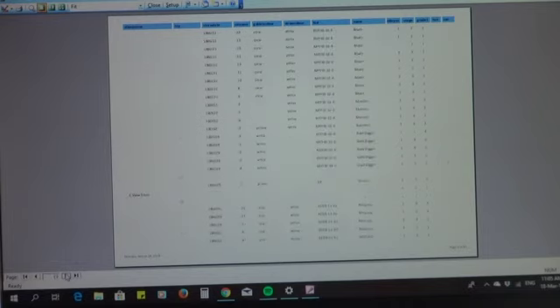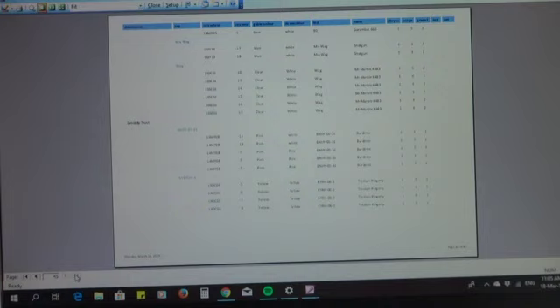Oh, there. Brown. Okay, so here's our donor that we just did today. He's got 1 embryo from donor number 45, collected on the 7th of May, and here is the embryo. But as you can see, this system is very poor. I'd really like Colin to be able to log into the system and find his own embryos so that he knows what he's got rather than me having to cut and paste this. There's not a huge number, there's 45 pages of embryos here, but this is my quiet time of year.